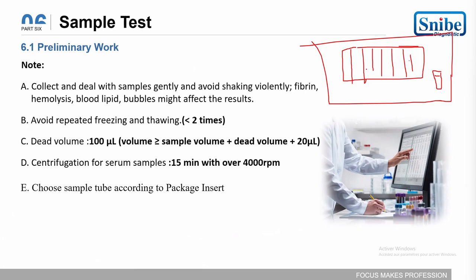But because we have 7 vials, that doesn't mean the quality control is running 7 tests. The calibrators are not used during the quality control. We just use the reagent and microbeads and the quality control solution during the quality control.